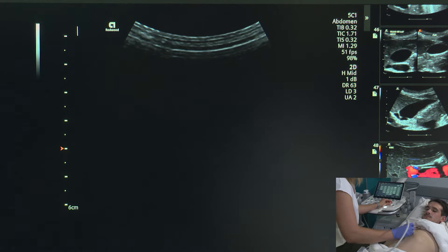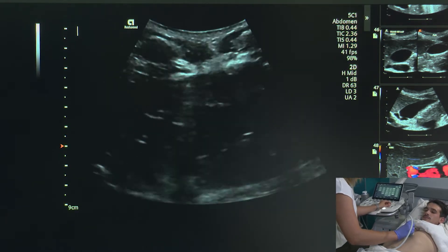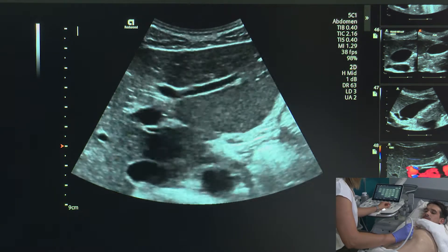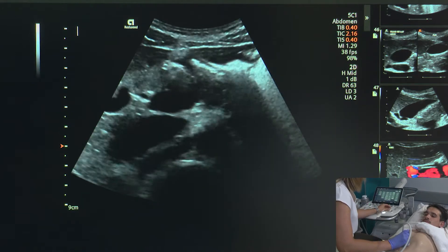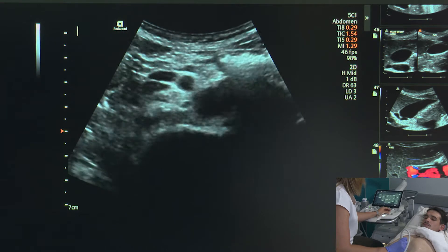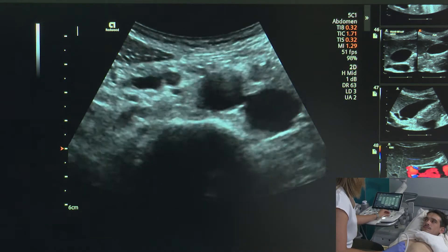When we interrogate an organ, we always want to make sure that we do at least two sweeps. So I'm going to start again just superior — a big breath in and hold that breath. Here we have the aorta that I'm following all the way down, and breathe normally. Once we get to about the mid portion of the aorta, holding a breath in doesn't really help us anymore — it's just about having enough pressure.